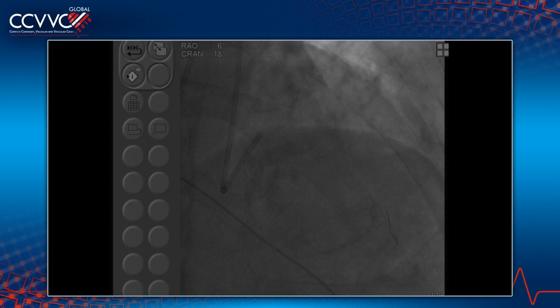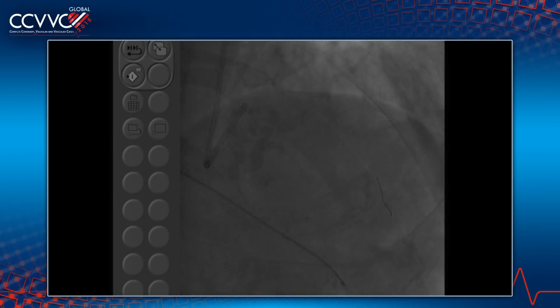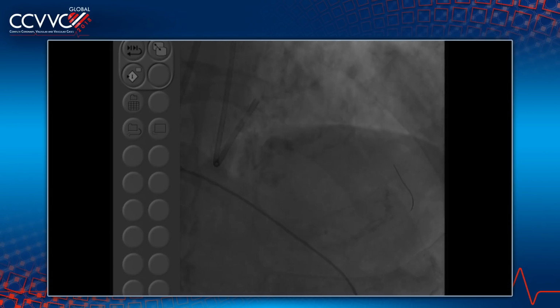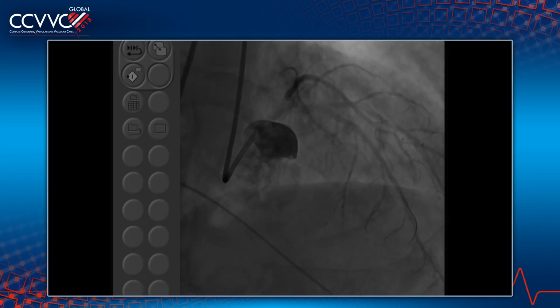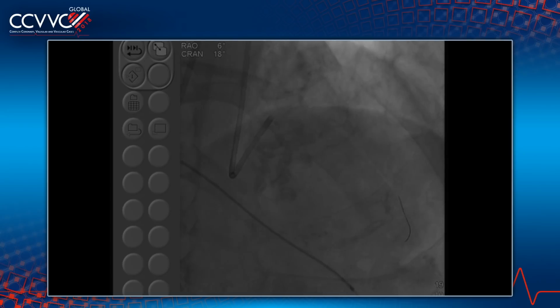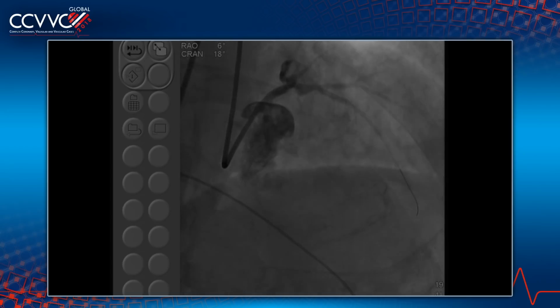Opened up, there is no AR. It's quite safe to go ahead and complete the trifurcation now, and then decide if we want to do the TAVR after. There's nothing wrong with it, but you're doing the valvuloplasty to make the PCI easier. Exactly, that is what we are planning here today. So we are doing the valvuloplasty, taking care of the left main, followed by the TAVR in about 4 to 6 weeks. And that is what we have been doing in the majority of our cases.